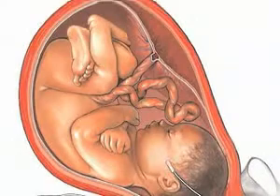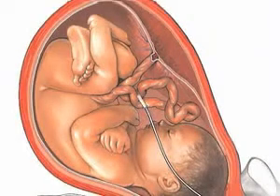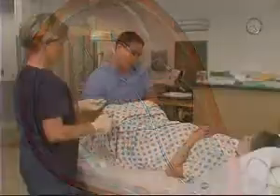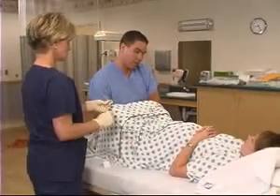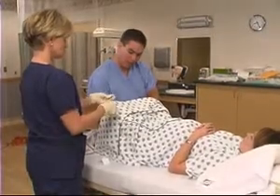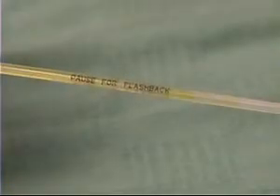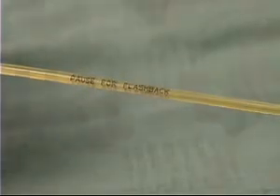It is important to note that amniotic fluid that is slightly tainted with blood does not always mean that the catheter has been placed extraovular. A little blood in the catheter lumen may be normal. If no fluid of any kind flows down the clear lumen, pull the catheter back and place it in a different quadrant until amniotic fluid is seen in the clear lumen. After proper placement is confirmed, hold the catheter in place and remove the introducer.